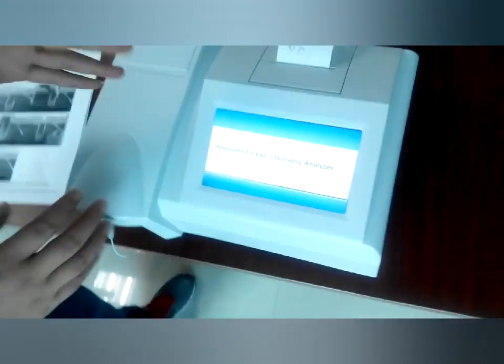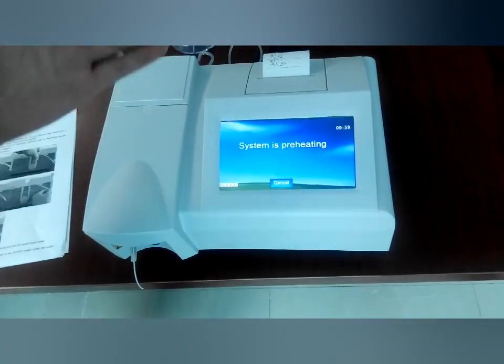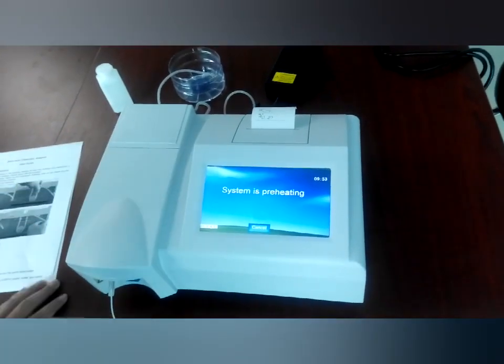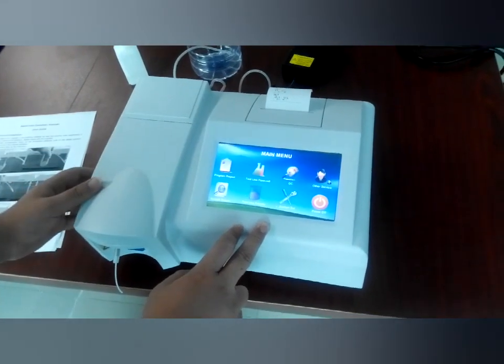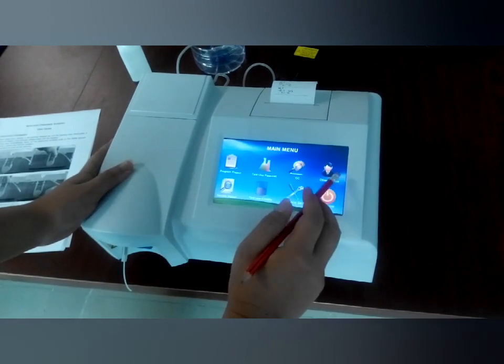Now you will see the interface. As usual, it is better to wait 10 minutes because the system is preheating, but it is also okay if we work now. Now it is the main menu and you can see the item programs here.